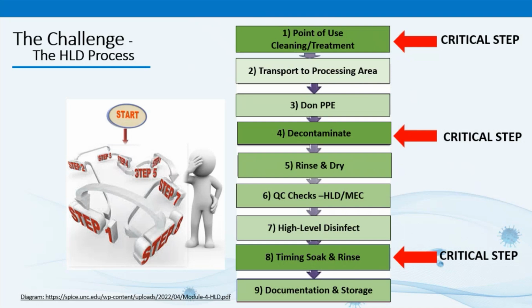In step five, that rinse and dry, they observed not thoroughly rinsing and drying devices before manual HLD.